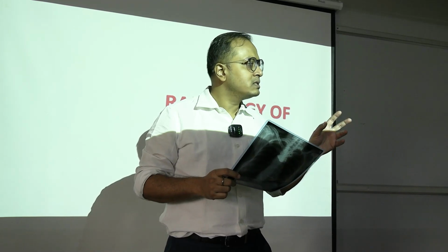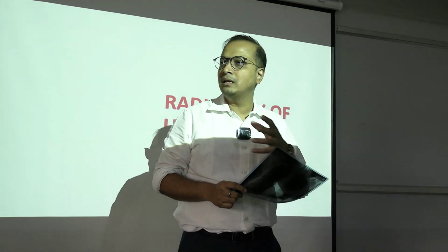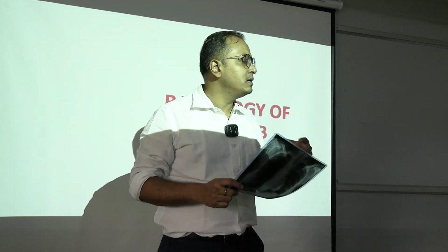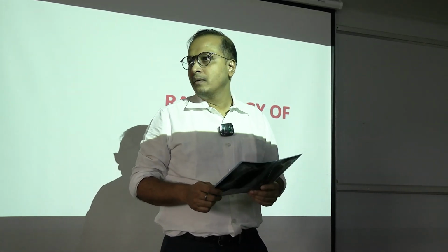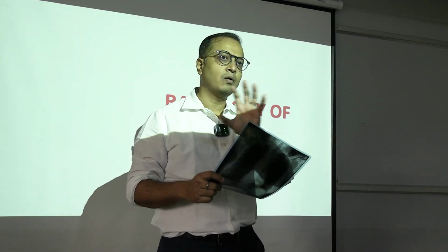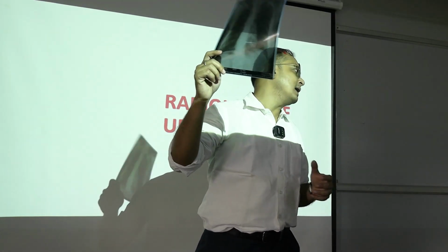Apart from that, we are going to see some of the organs and viscera, whether they are completely penetrated or partially penetrated, especially for lungs, where we get a silhouette. If it is partially penetrated, like the heart and the coverings of the heart, we will get some kind of in-between shadows, and a mixture of things together, depending on how these particular organs are placed. Now this makes this particular plate a plain X-ray.